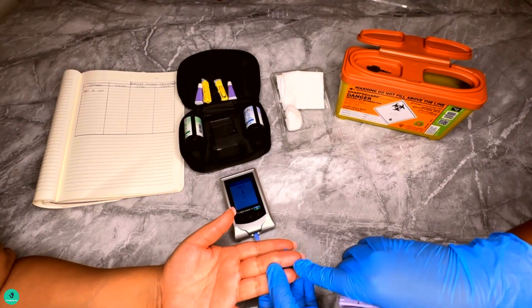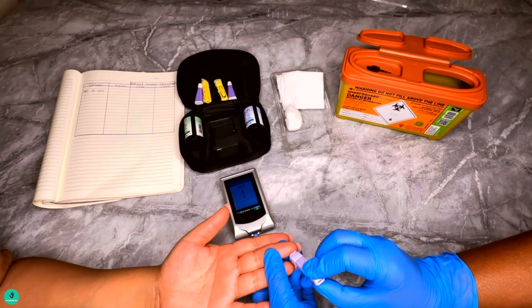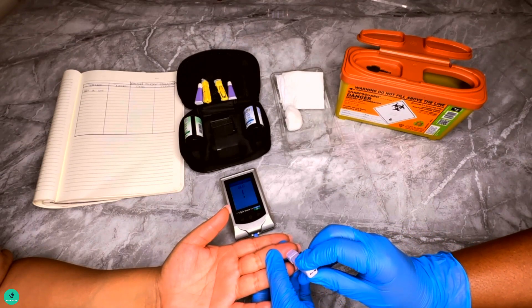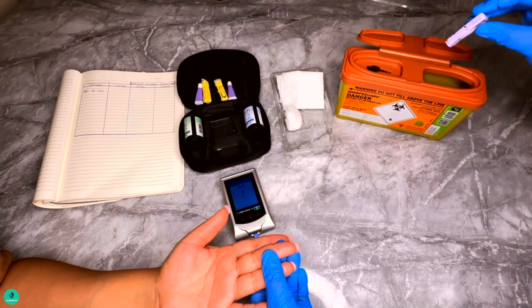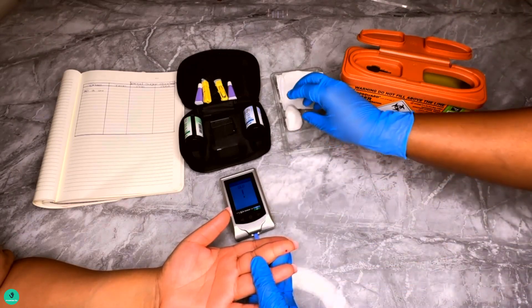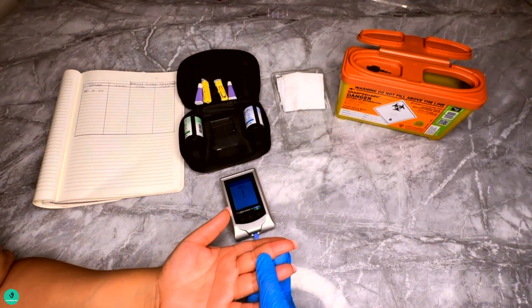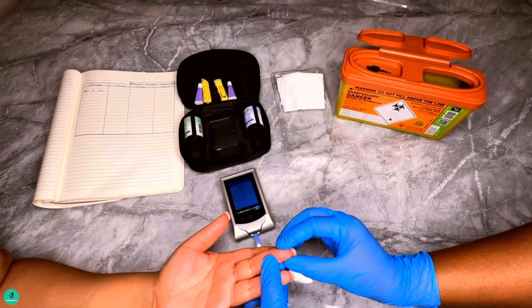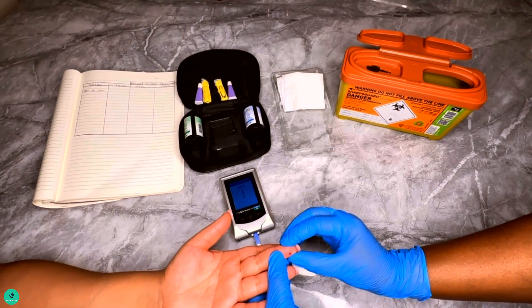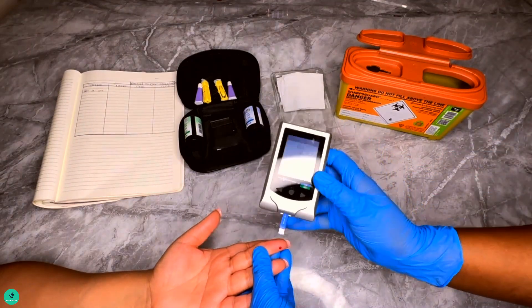You may need to squeeze your finger just a little for blood to appear. Number six: when blood appears, check the meter is ready and then transfer the blood onto the test strip and wait a few seconds. Most meters these days provide a result within 10 seconds or even sooner.